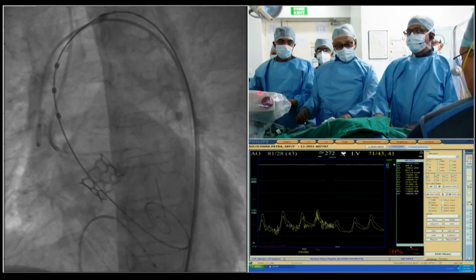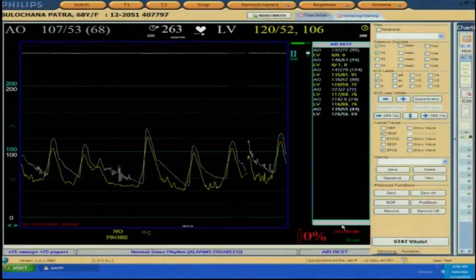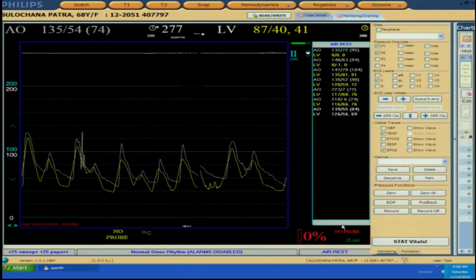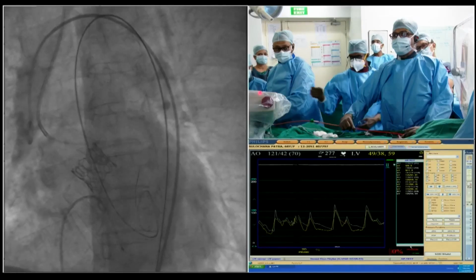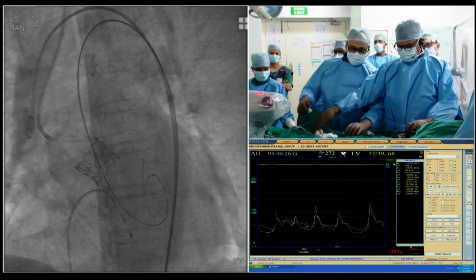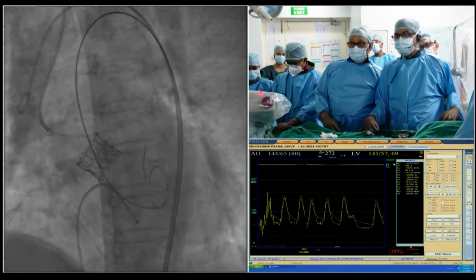We can't see the ECG very well. Okay, good. Can you show the EKG, please? We're getting the system out first. Okay, thank you. Let us see. A couple of things to look at first, actually. Let's look at the coronary injection.